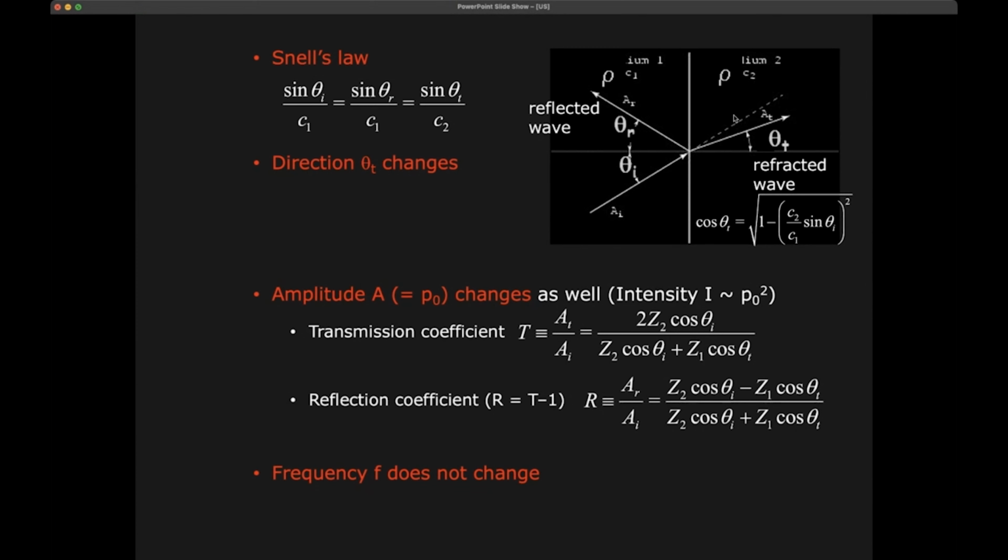So we have on the one hand a mirror reflection, and on the other hand a propagating wave where the angle is changing, and the angle is changing depending on the speed of sound difference between the two media. And what we can do is calculate the amplitude, as well as the incident and the propagating angles, and we can express it as a function of the acoustic coefficients of the waves.